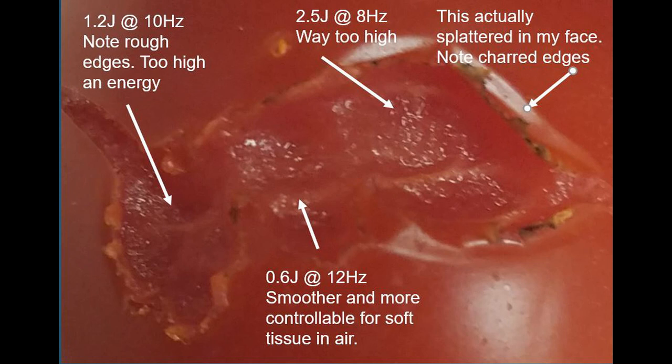So here you see that on the left we started at 1.2 joules — that's still kind of high to be using in air and you can see the rough edges around the vaporization. In the middle at six tenths of a joule, all of a sudden we're getting a smoother and less concussive effect. Typically in soft tissue, 400 to 800 millijoules might be typical. Way on the other side at two and a half joules, that's just way too high — it's explosive and even splattered the tomato right up into my face. So once you decide the effect you want, just look at the trends: pick a spot, see what's happening, and take it up or down as needed.